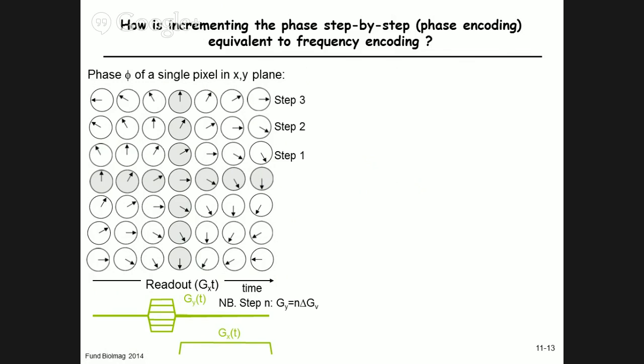Now, if you have a phase that changes linearly with time, here, we know we have a phase that changes linearly with time, so there's a frequency associated with it. Now, the computer doesn't know that there's time here for this. For the computer, that's just a two-dimensional matrix, but this could also be just simply associated with the time. There's a phase that increments with the second dimension of this matrix, so there's a frequency associated with it. And in effect, you can take the data recorded like this, transpose it, and you can still produce an image. It has the same effect.